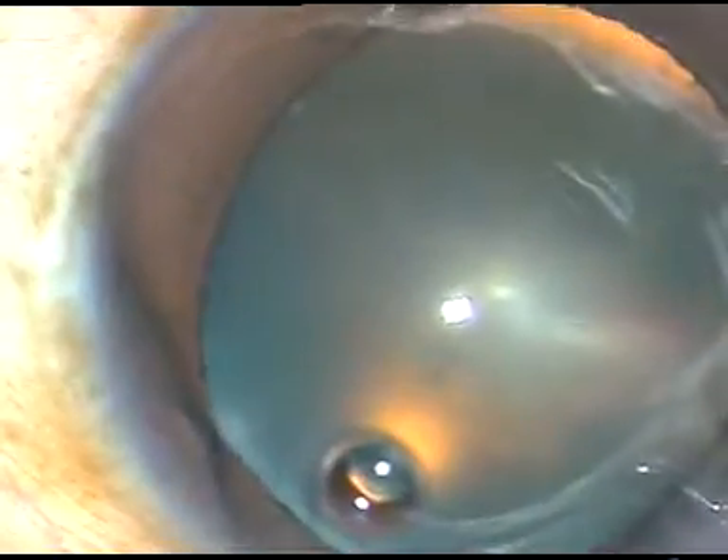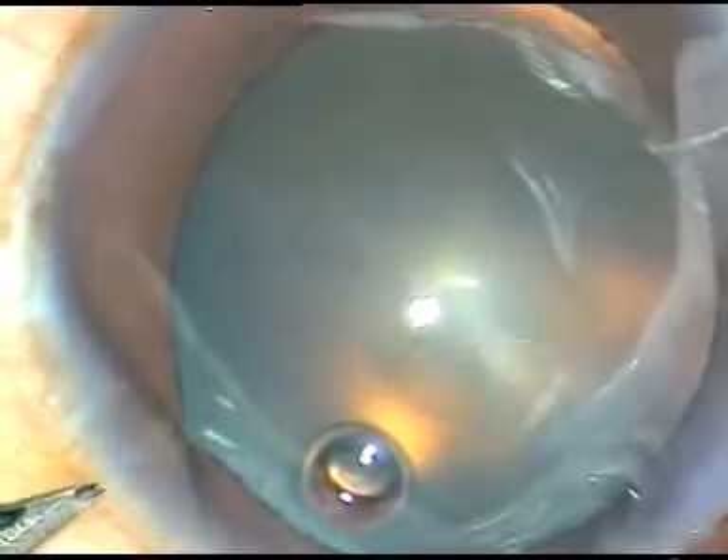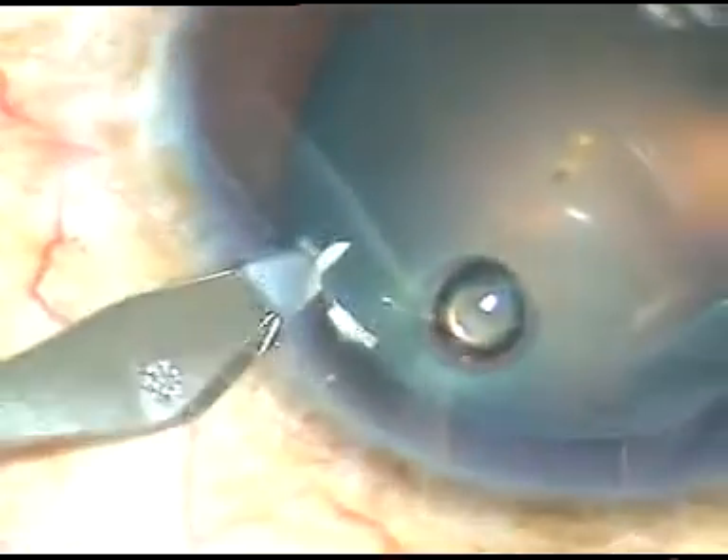This is a side port on the right side of the main incision and this is another side port on the left side of the main incision.